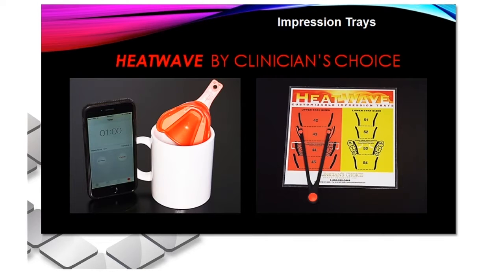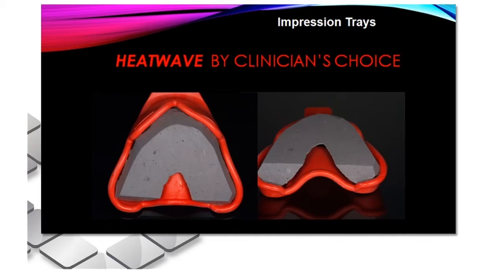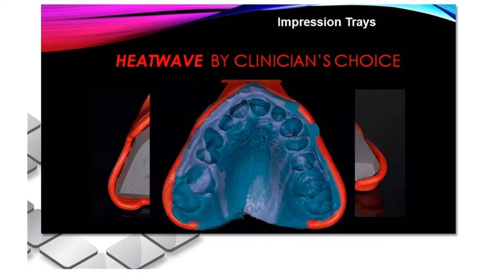Now, if I have to customize it, I drop it in hot water for a minute, typically right out of the microwave, and at that point I can then take a model and adapt this. As you can see right now, it's not fitting. Take my thumbs and I can adapt not only the back but also the palate and all along the whole buccal corridor to create an impression that allows for a very thin, accurate reproduction of those teeth.